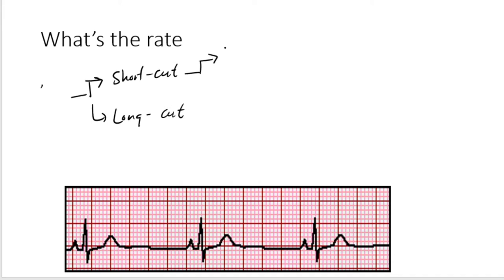The shortcut, the prerequisite is there should be a regular rhythm. You can only use it if the rhythm is regular, which means from the R to the R, it should be the same from this R to this R. That's the regularity. You can't be doing it in irregular rhythms, otherwise it will not be accurate. So the short method, as it is, it's very fast, but it's not the most accurate.